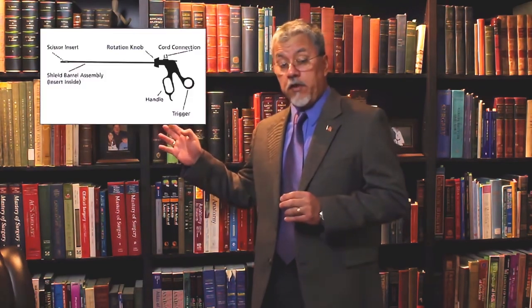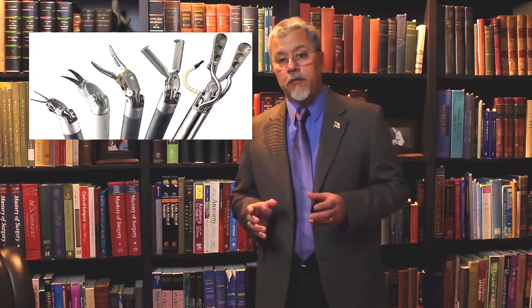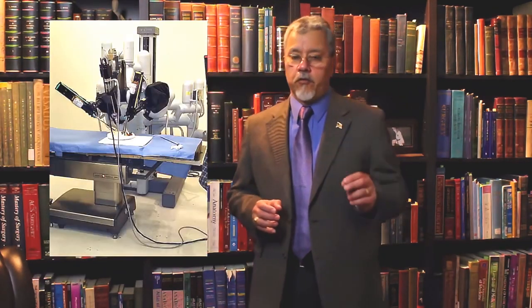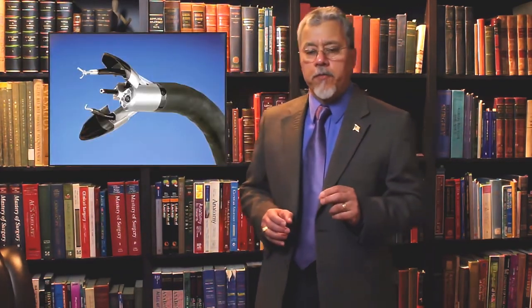In 1990, laparoscopic surgery appears with laparoscopic cholecystectomy, and new instruments are now needed that can enter through a small port instead of large incisions. These instruments, some of which you can see here, are specifically designed for this. So what's in the future, which by the way is right now? Instruments are being developed that can be used with robotic surgery, minimally invasive robotic surgery, NOTES surgery, natural orifice transluminal endoscopic surgery, instrument that can be used through an endoscope. The future is bright for surgical staplers.